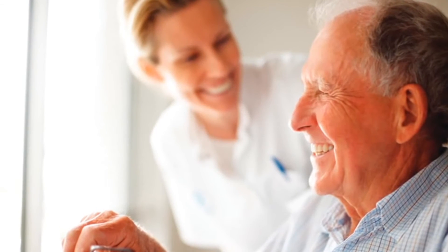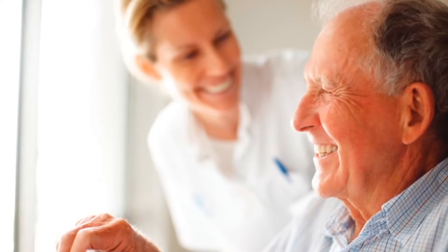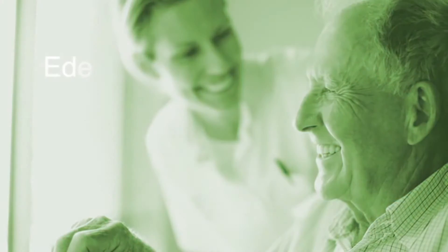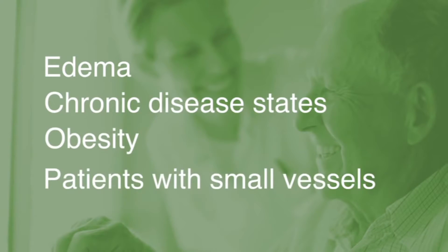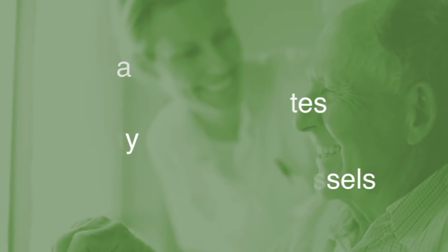Which of these patient challenges do you experience in your daily routine? Edema, chronic disease states, obesity, anxious patients with small or deteriorated vessels? Identifying vascular access options on these patients can be problematic.